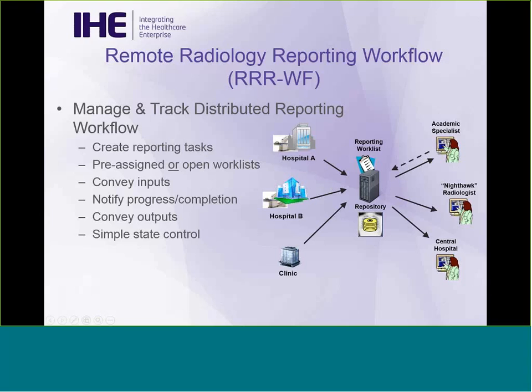So this is a reading task, and you need to be able to point to the images that are to be read and also provide inputs like lists of priors and where those can be accessed from, previous reports, other clinical documents. So you need to be able to reference the necessary inputs for the reporting task. You want to be able to monitor and notify about progress and completion.